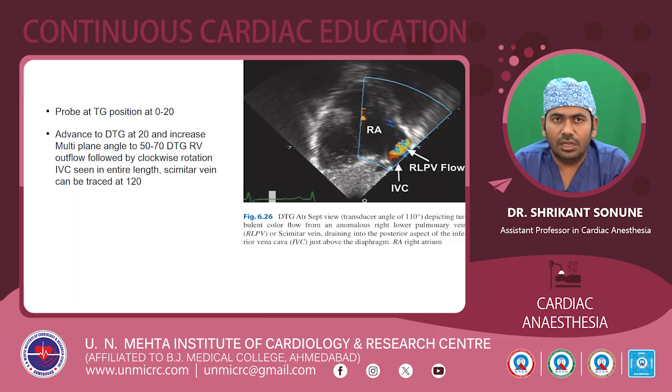After doing a clockwise rotation at this level, the IVC can be seen in its entire length. After tracing the IVC through its length, the abnormal scimitar vein, the abnormal venous connection, can be seen, which can be traced at around 110 to 120 degrees.